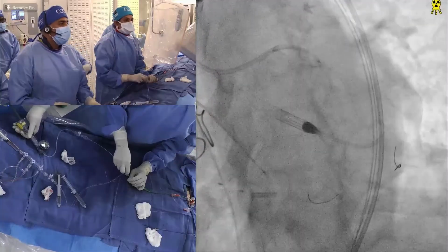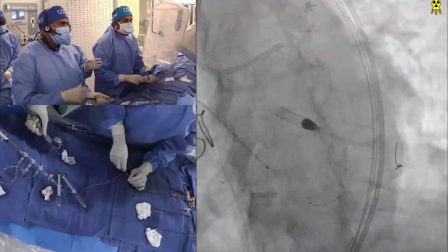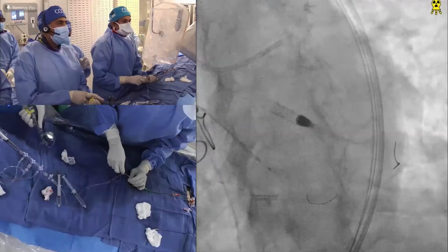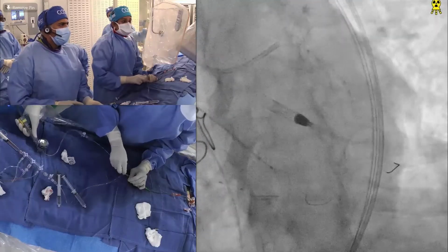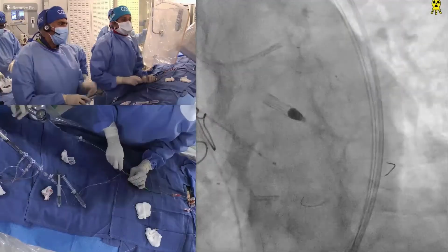So what happened is, where you want to rewrap the balloon, you come in the guide and go up to high pressure. In the guide, you go high pressure, so basically now your blood pressure will become flat, negative. So basically you have done what the company does. Remember, all balloons come with the additional attachment. A 2.5 12 balloon. Okay.